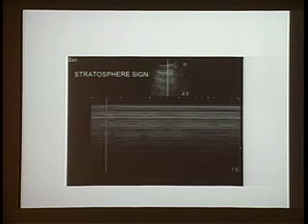If you happen to have no lung underneath, you have a pneumothorax, look what happens. You put your M mode, and they're just lines, lines, lines. You don't have that hazy sand appearance that you have there. That's called the barcode sign, because it looks like a barcode, or the stratosphere sign, which is basically a reference to airplanes flying high. When they leave those trails of water vapor in the atmosphere, they leave little lines like this.